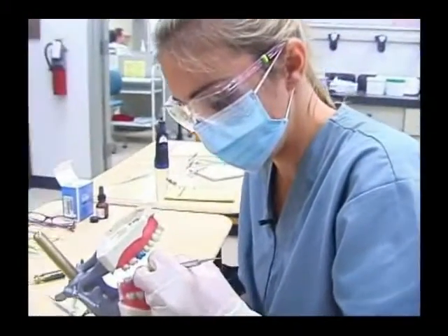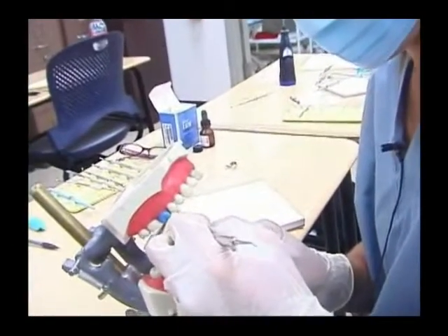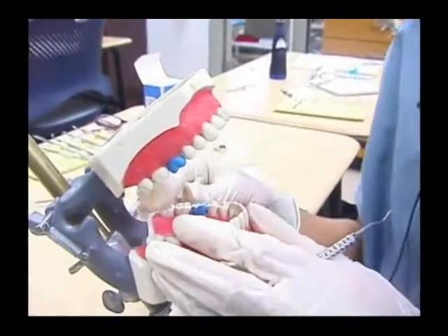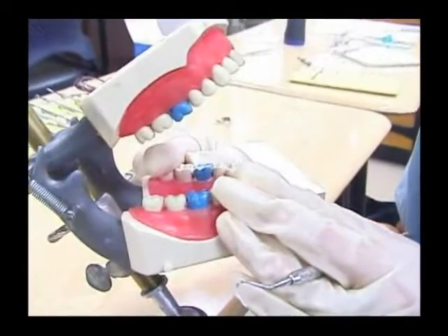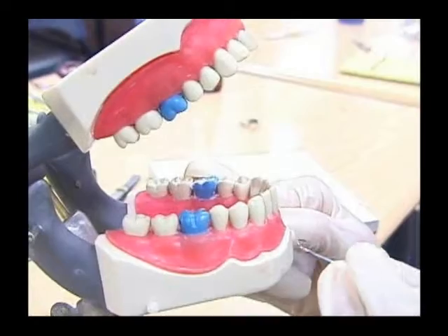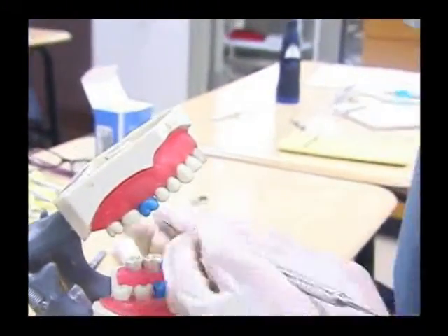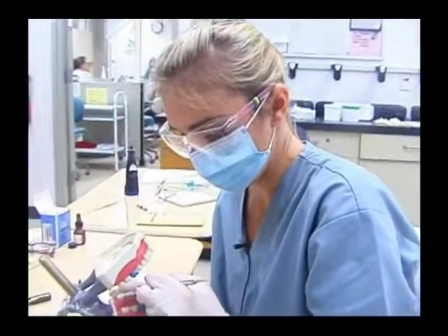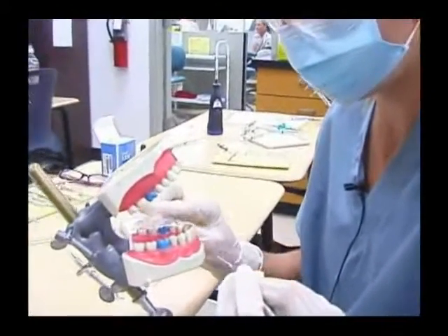So what we're doing is we are taking the cavity prep, which the doctor has already prepped, and basically filling it. We want to have closed contacts, which means contact with the teeth, and then we want to make sure that we're not over the occlusal surface of the tooth, and that our margins are sealed on top.